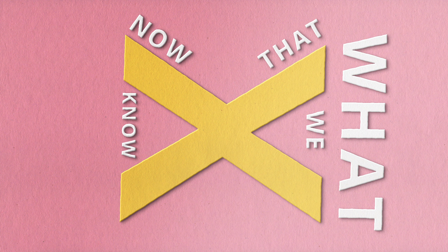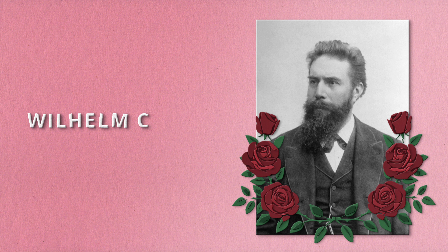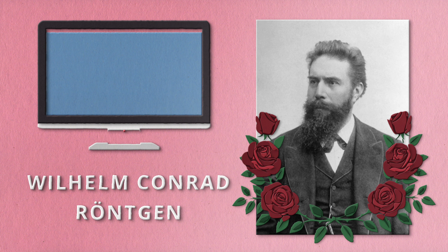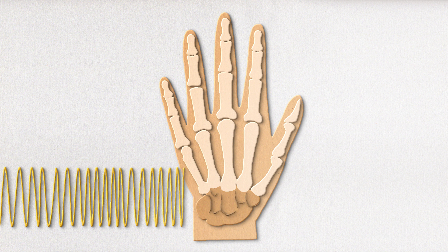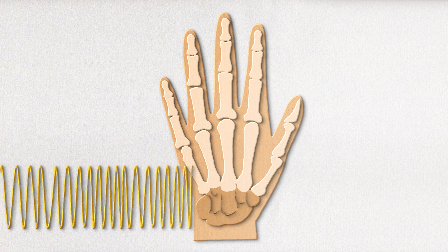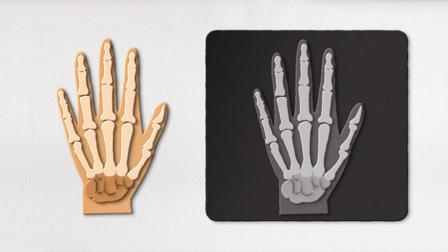Now that we know what x-rays are, we need to find out how they work. In 1895, physicist Wilhelm Conrad Röntgen made an accidental discovery. He noticed a glow coming from a nearby chemically coated screen. After conducting a series of experiments, he learned that x-rays could penetrate flesh, but not higher density substances such as bone. Later, he discovered that x-rays could be photographed, producing black and white images of the inside of the body.